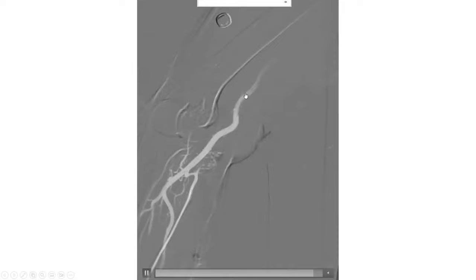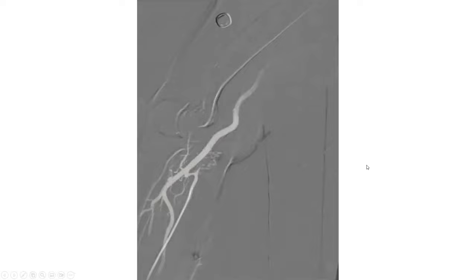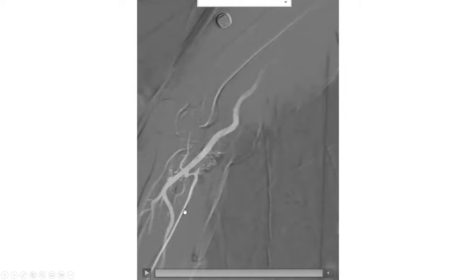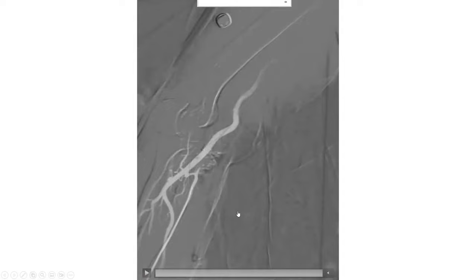Watch here how it goes — it takes the loop and goes up. You advance it as deep as possible. Then the next step is to advance over it the softest 4-French catheter that will allow you to eventually exchange the O14 for an O35-inch wire. So over that, we advance a 4-French glide cath. Notice that the loop had already straightened with the whisper O14-inch wire. I use a 4-French glide cath, which is the softest, most slippery 4-French, that has enough lumen to allow exchange for an O35-inch wire.